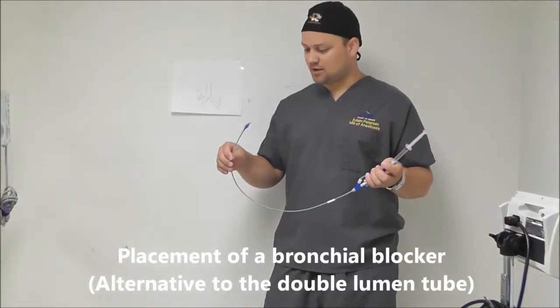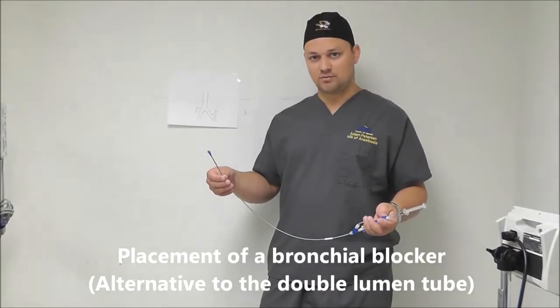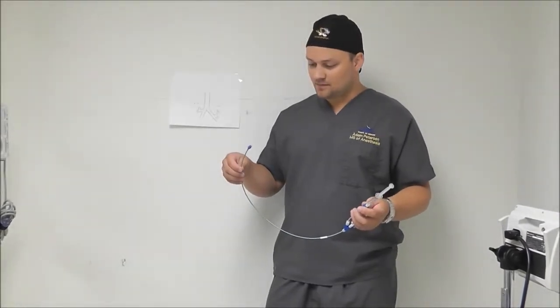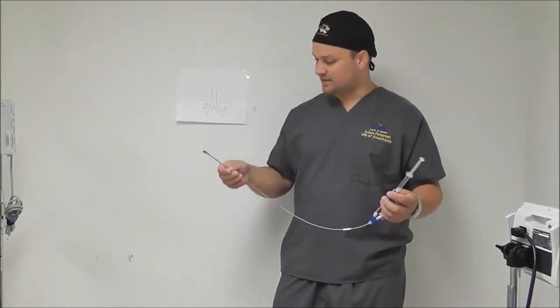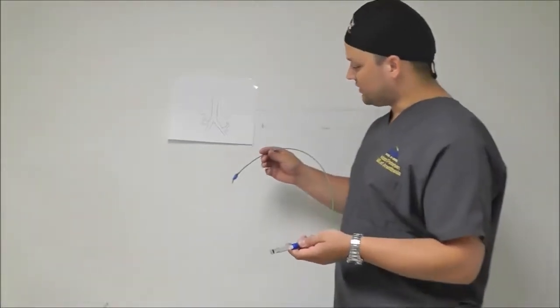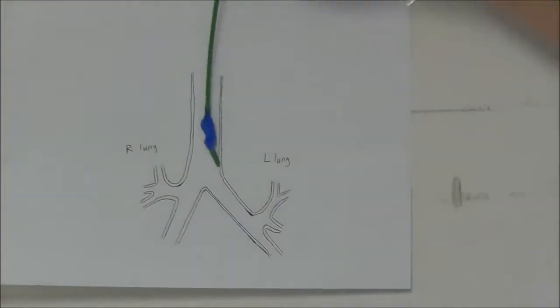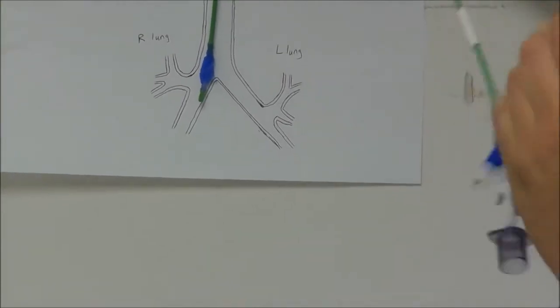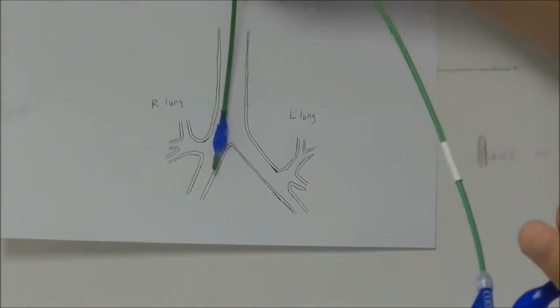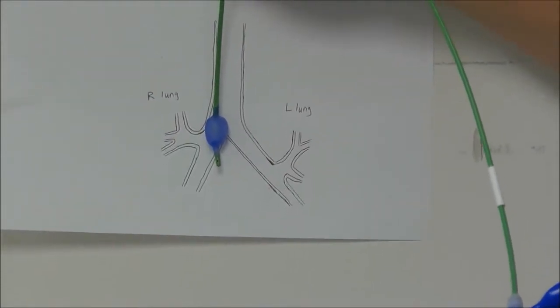This is a bronchial blocker. You can use this as an alternative to a double lumen tube for isolating a lung. It's basically a tube exchanger that's hollow with a cuff at the end. Using a regular endotracheal tube, you can pass this bronchial blocker down into either the left or the right lung. Once you're in the correct placement, you simply inflate the balloon to isolate the lung.